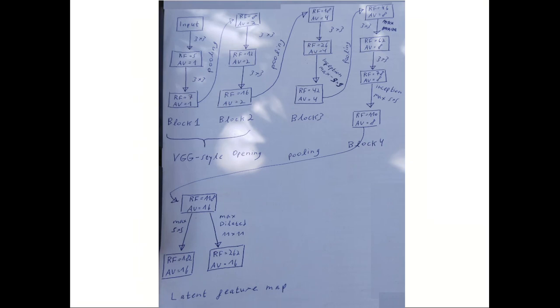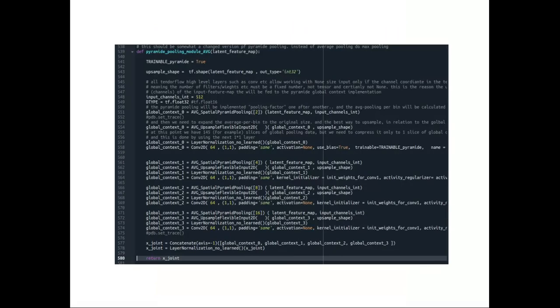A few minutes of calculation gives us accurate numbers regarding the principal receptive field in every layer of our evolving model. Thus, we could easily make changes in the architecture if necessary. In my model here, the receptive field of the final feature map is 182 by 182 pixels. That is if we consider only the dense filters. If we include also dilated convolutions, the receptive field could potentially cover almost the entire image.